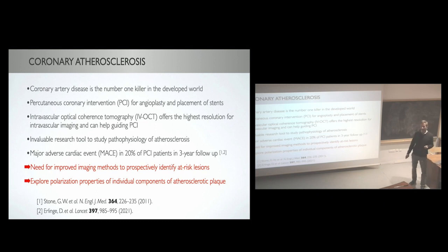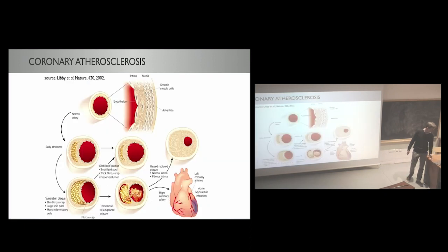And so the idea is if we could prospectively identify lesions that are likely to cause events in the future, you could do something about that during this first visit. And that's where we thought that maybe with polarization we could make a contribution.